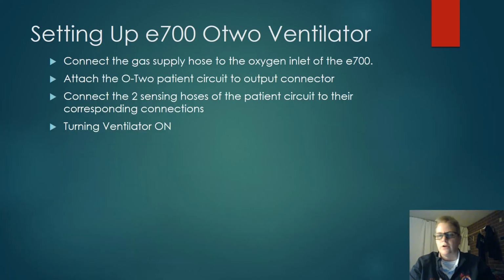These next slides are just setting up that ventilator, okay? So I'm going to let you go through those by yourself without me talking through it, and I'm going to meet you over at the troubleshooting part.